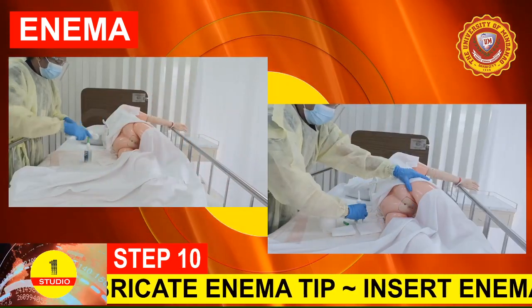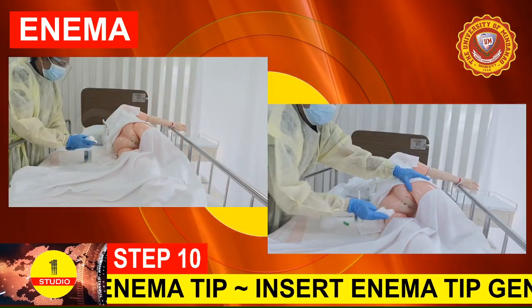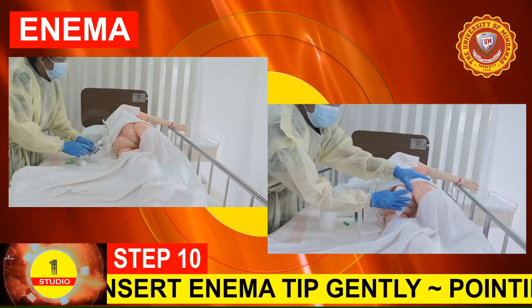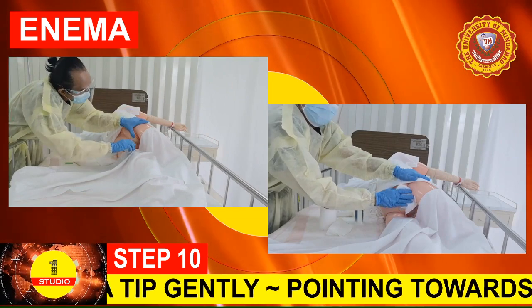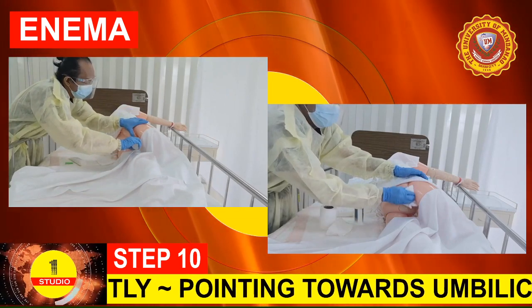Step 10. Administer the fleet enema. Apply a lubricant gel onto the tip of the fleet enema. Insert the enema tip into the client's rectum slowly and gently, pointing towards the umbilicus.